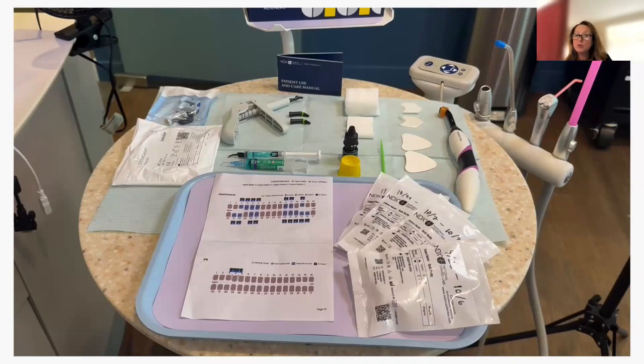I usually will have my tray loaded and ready to go. Depending on how many attachments, I usually do one quadrant at a time. So here I am, I'm in Michigan, I'm our RDA, so I can do this, place the attachments. I only like to do one side at a time because I only have two hands. I keep trying to grow those extra two arms and hands, but I haven't been able to yet.